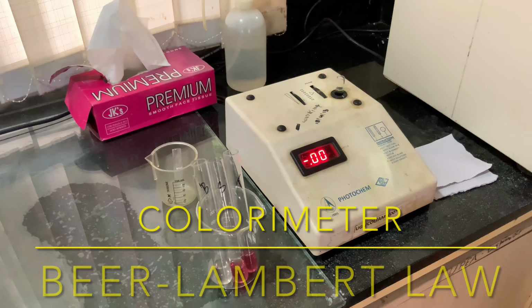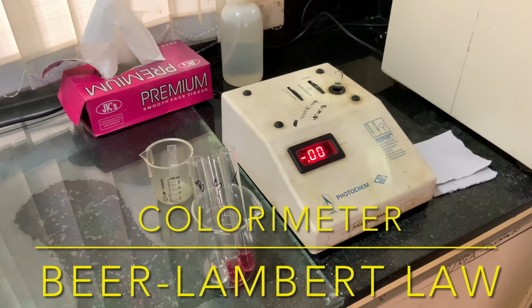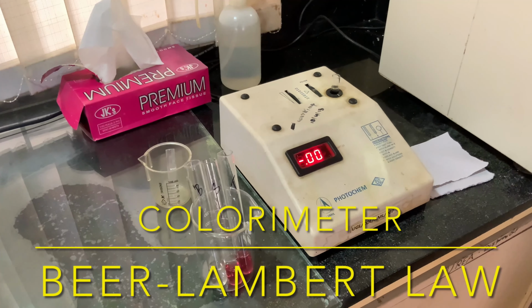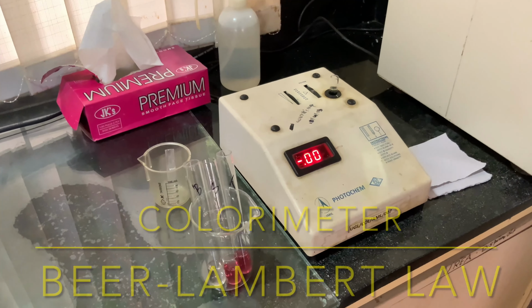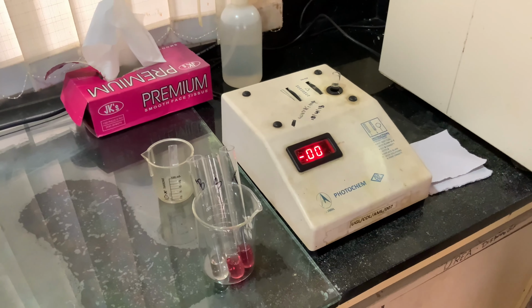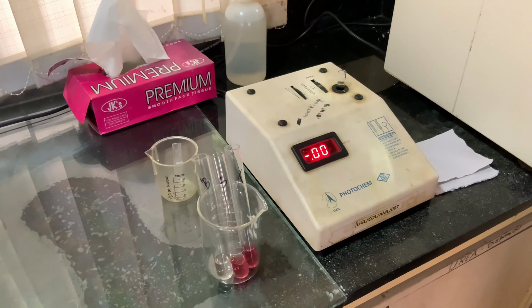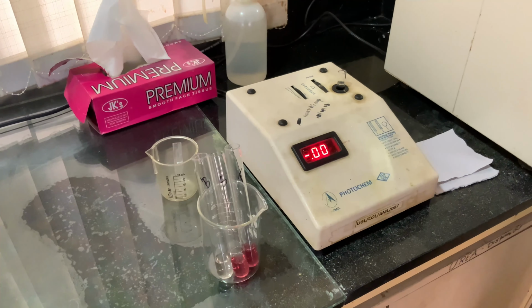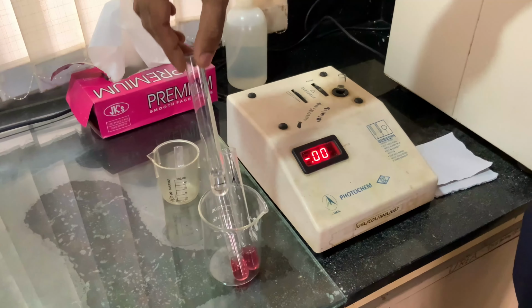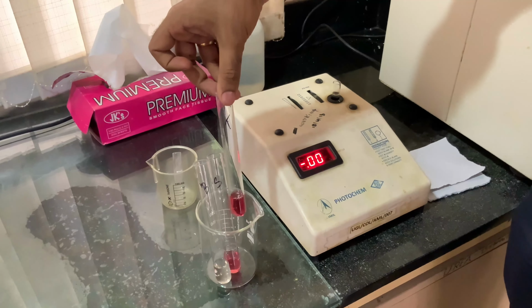Now coming to the analytical phase, the analysis of the sample is done using instruments like a colorimeter, which is based on the principle of Beer-Lambert law. The OD value or absorbance of the different solutions are measured using the colorimeter. The OD value of three different solutions are measured, being blank, standard, and test.